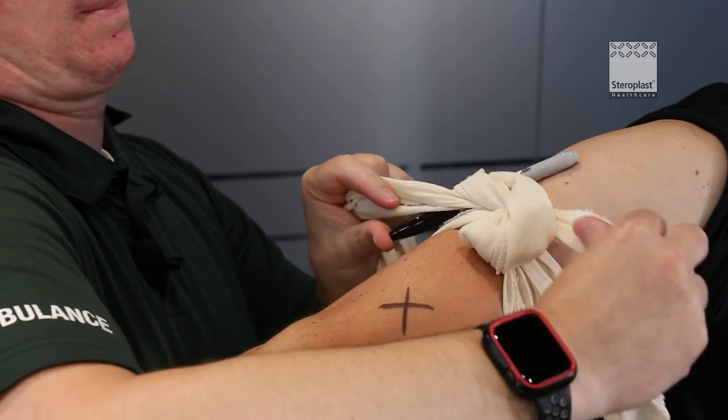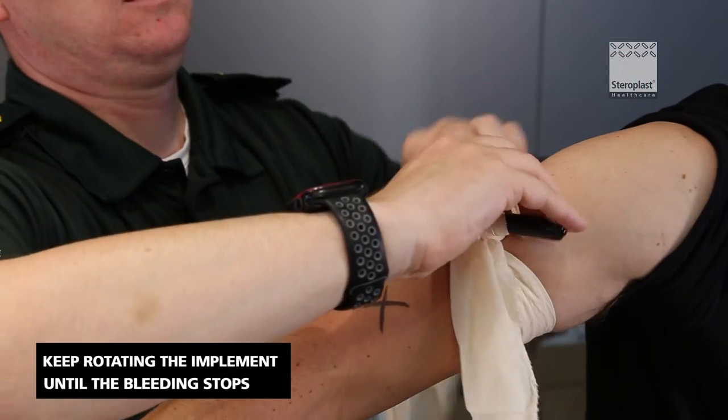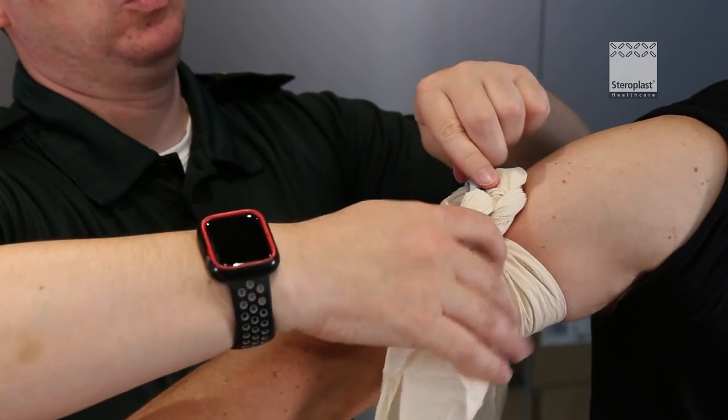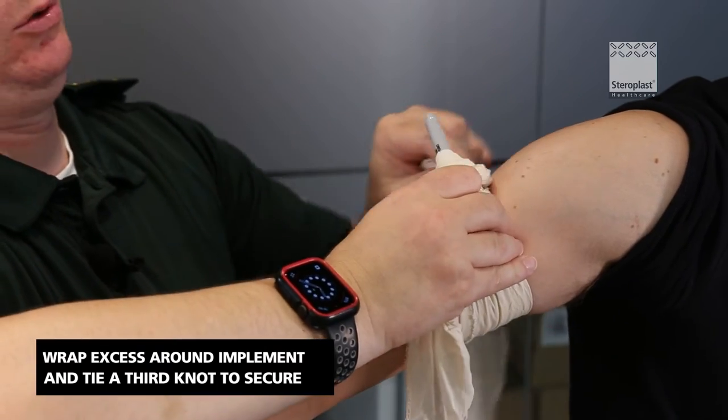Pull it tight and now twist this round to create the pressure required. Turn it as many times as needed to stop the wound bleeding. Once the wound has stopped bleeding, just a wrap or two around whatever you've used.